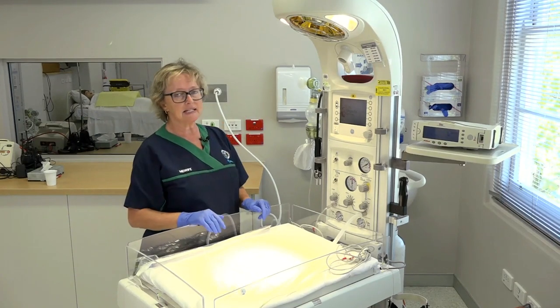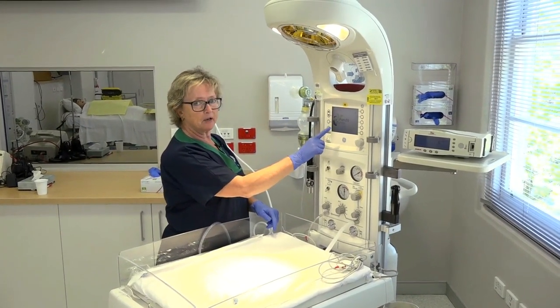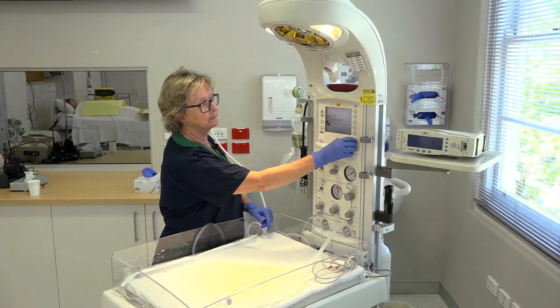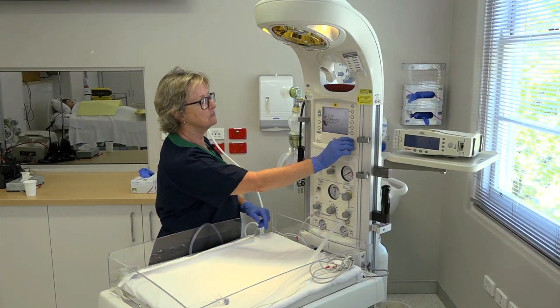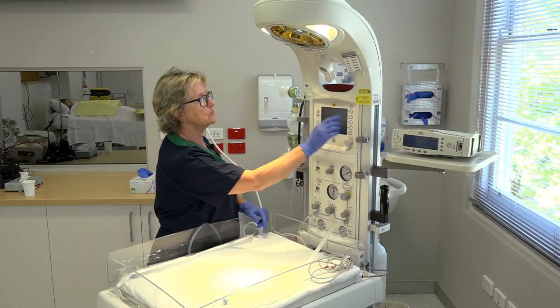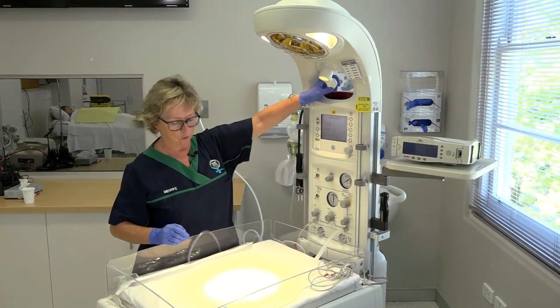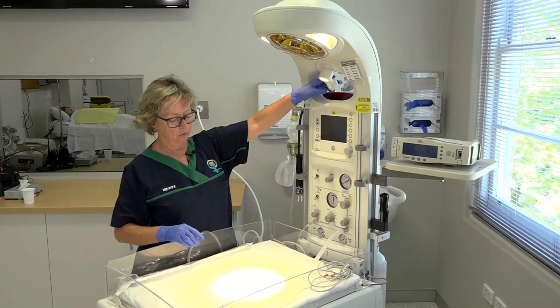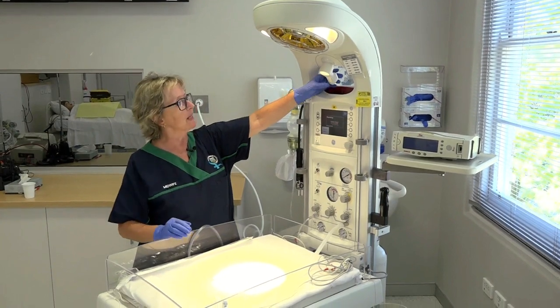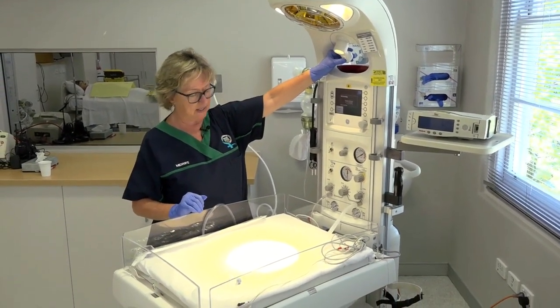You'll notice that the light immediately came on, so while the computer is going through its checks, we can check that our light can dim — which is perfect. It goes down and can go quite bright. We can also make sure that the directional light, which we use for procedures, works as well. It's really nice if you want to put a line in — you can direct it exactly in the right spot.